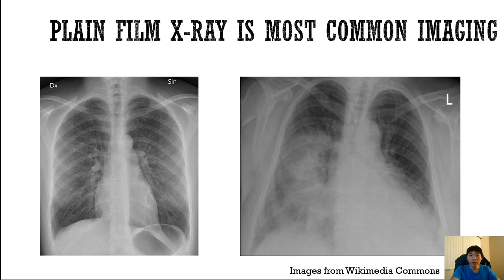and on the right side there's actually a bubble in the stomach. So what we can do is have a look at a patient who is not doing so well. On the right, we have a patient who is showing some increased opacity in the lungs. You see a little bit of consolidation within the lungs, which most commonly indicates a buildup of fluid.